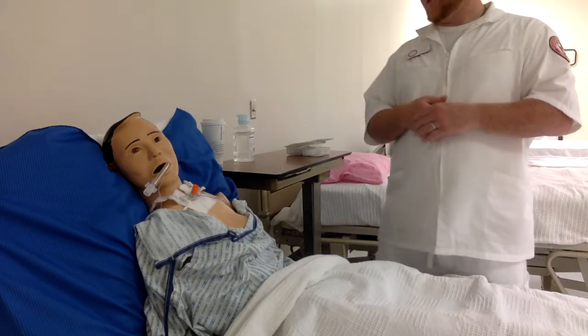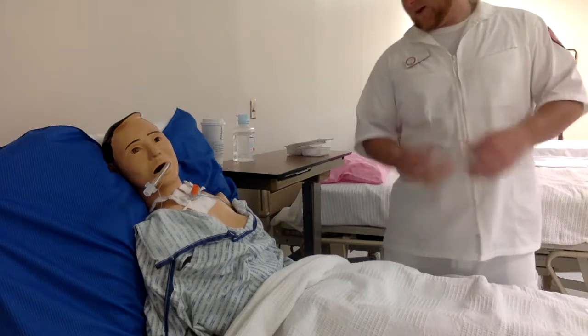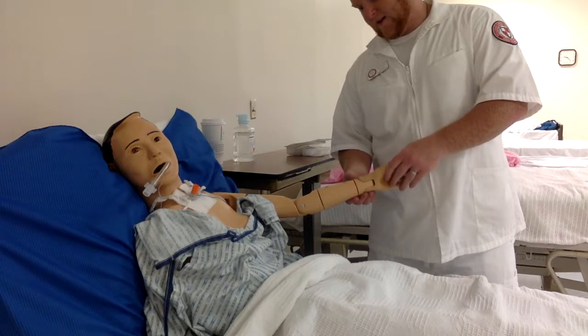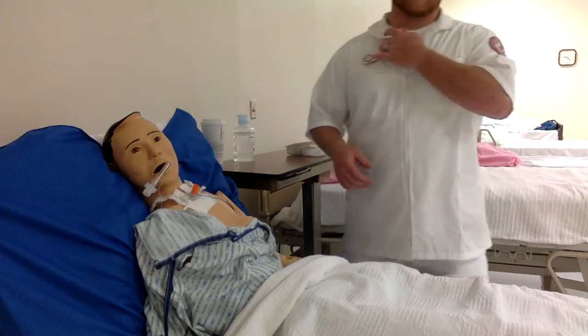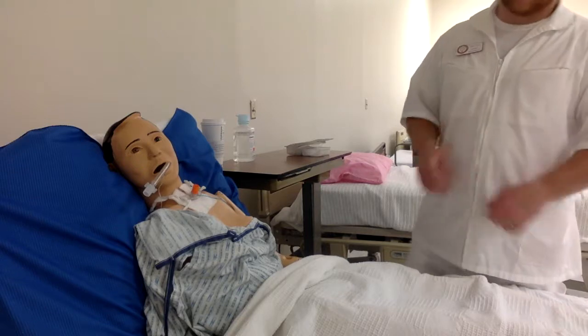You also need to make sure to properly identify the patient by having them state their first and last name as well as their full date of birth. Once that's done, the patient has been properly identified.